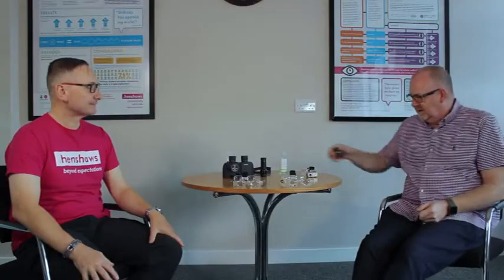Yeah, okay. So what starts to happen if you start trying to read or something with a monocular or a magnifier? We've got a problem, haven't we? Yeah, we've already got one hand. I always wished a part of my low vision assessments could have been growing somebody a third hand, because they could have held the book still and the magnifier. Right, yeah. So you start running out of hands really.